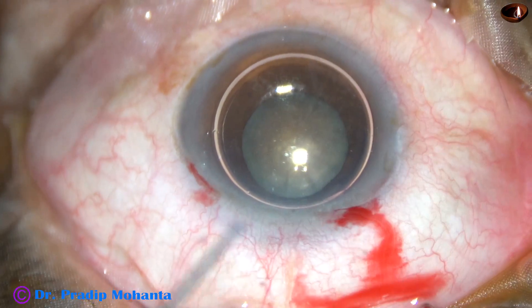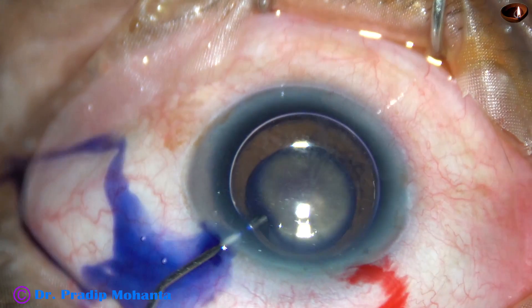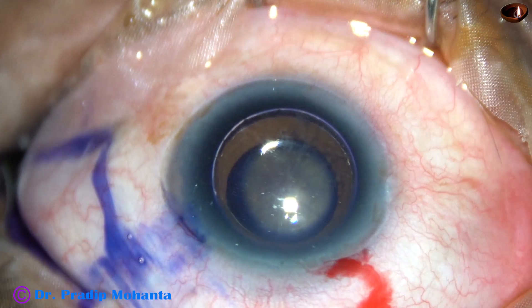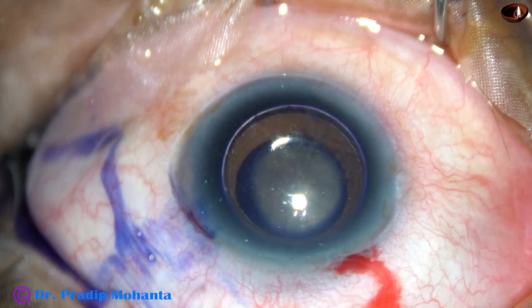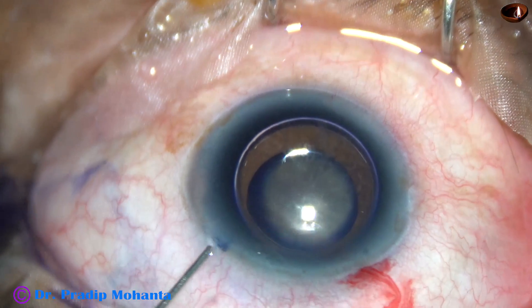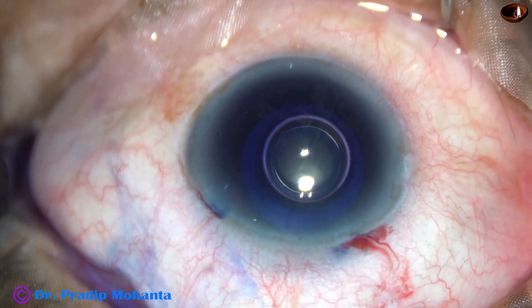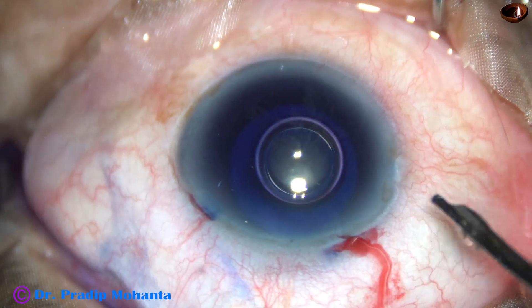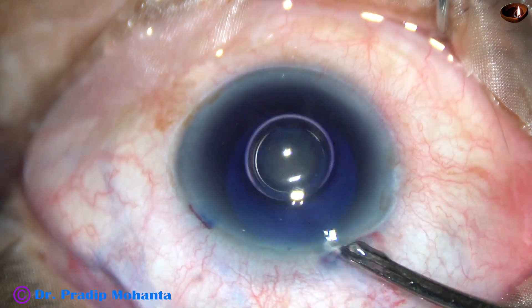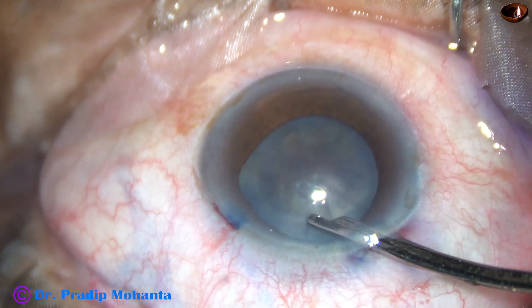Now I am going to stain the anterior capsule of this cataract with trypan blue dye. We can see the pupil has not dilated well in this case. The size of this pupil is about 4.5 mm. I used adrenaline to see if the pupil dilates a little more, but it didn't dilate much.